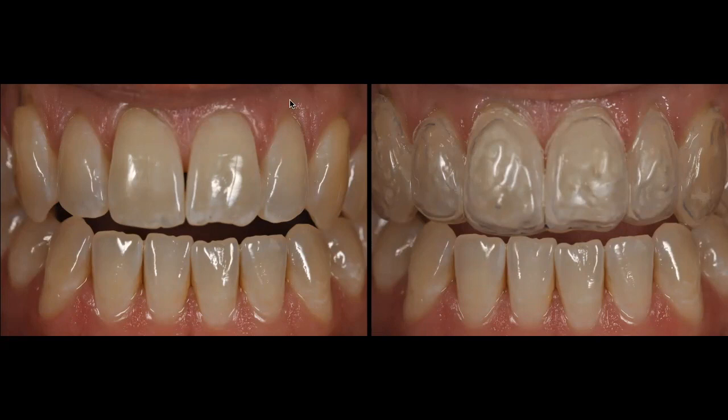And you can see again here, thin biotype, very scalloped tissue, and some recession already present. This is the reason why I wanted to make sure that there was no risk of me having the 20% carbamide peroxide in contact with the gingival tissue. This is the day that we were trying in the tray. You can see the reservoirs. The patient now understands that there's some space in there for him to deliver the bleaching agent. He doesn't really need to use a large size, but you need to have a size of the product inside the intaglial surface of the tray big enough in order for it to contact the tooth.